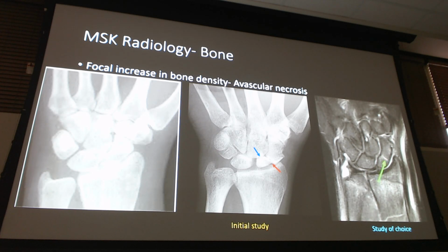And then don't forget, there'll be at least one, not more than one, but at least one normal X-ray. So you gotta know what normal looks like. It's not just about finding the abnormalities. It's about looking at it and going, you're fine. Just go to physical therapy or give it a couple of weeks and come back, right? That's just as important as finding the fractures.